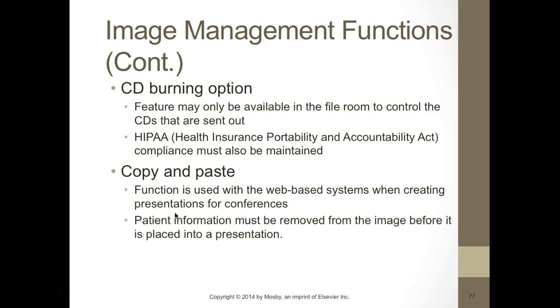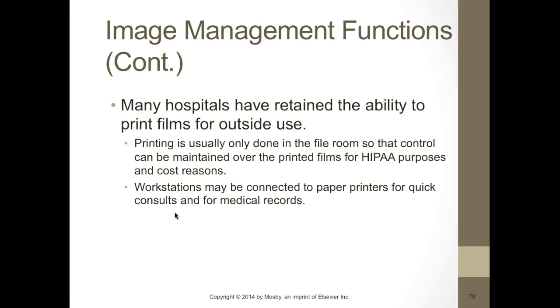So CD burning is a feature that's available. A lot of times you can send stuff to the CD burner or you can send them to the film library. It's a good idea to send them to the film library as they'll make sure that HIPAA is being followed. And copy and paste, that's not a function that's typically used. When we use copy and paste, we'll anonymize the images so that the patient information and demographics are removed, and then you can use them for teaching or PowerPoints or whatever you need.